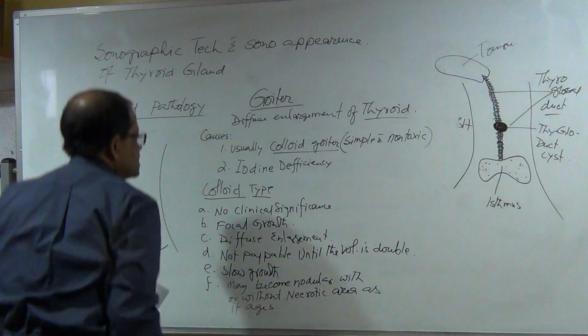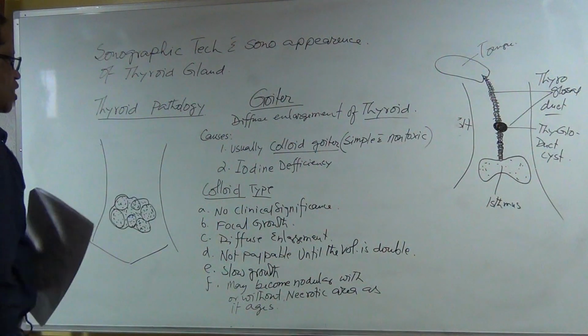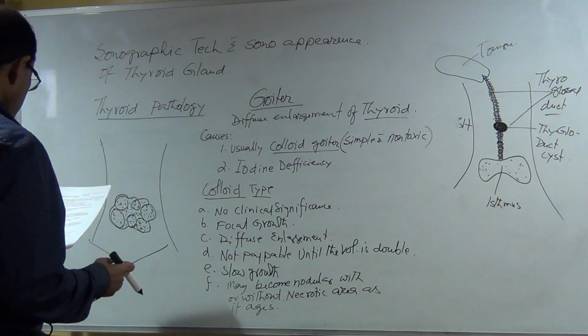Okay, so this is the clinical criteria of colloid type.